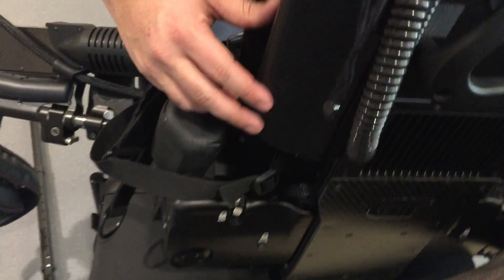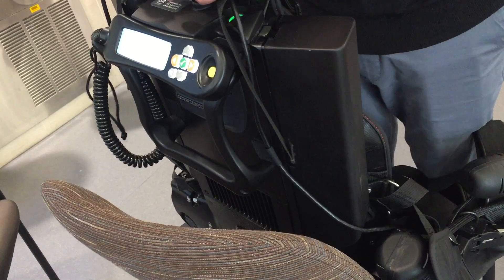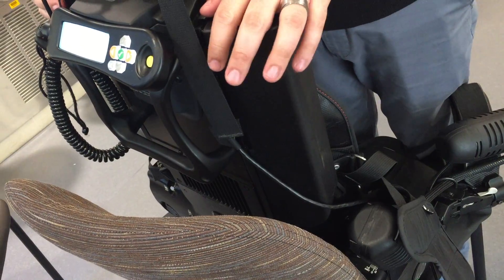It's powered by two lithium ion batteries, one here and one here. Each battery is good for two to three hours of use depending on the intensity of usage, and can be recharged in 45 minutes.